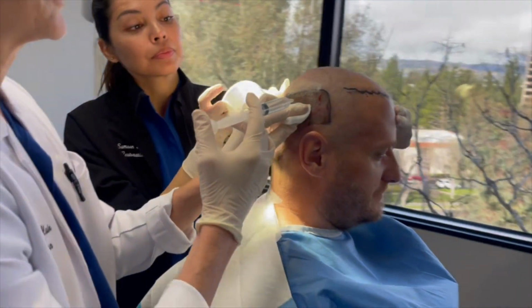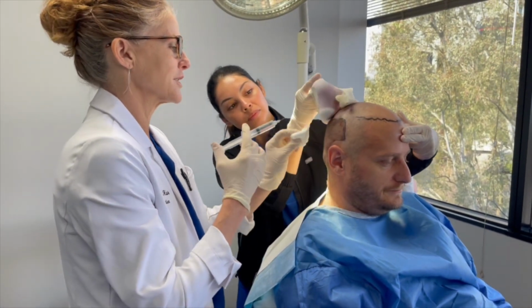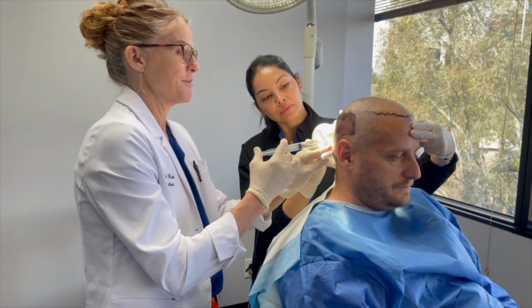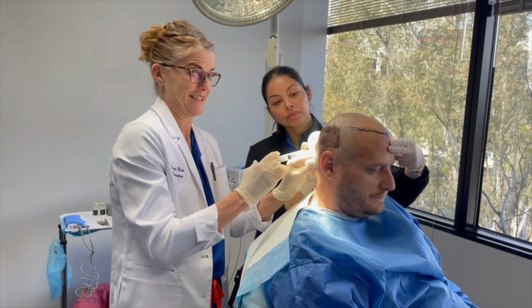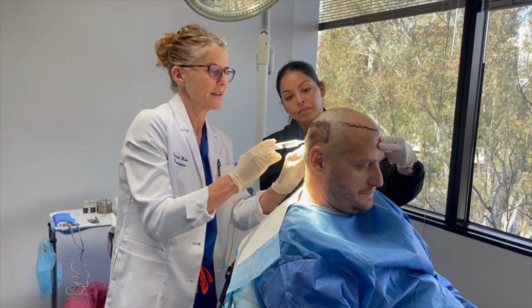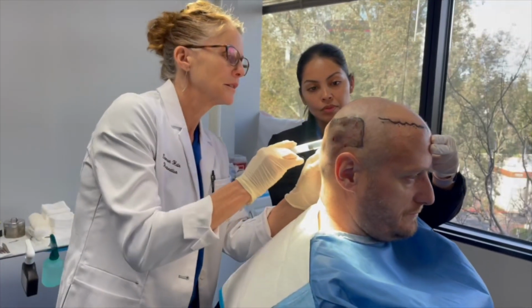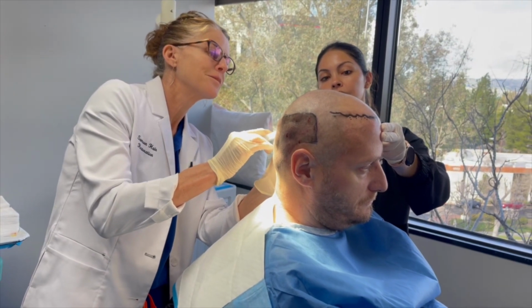So TJ already knows that he, in general, requires a little more anesthesia. So I'm going to do one round and then I'm going to let it sit for several minutes. If people know that about themselves, it's good for them to tell us because we need to use a little bit more and take a little bit more time. Okay, we'll check back in the next phase.